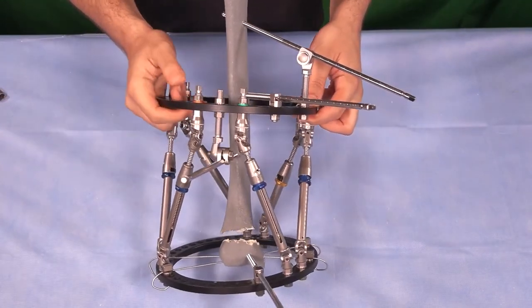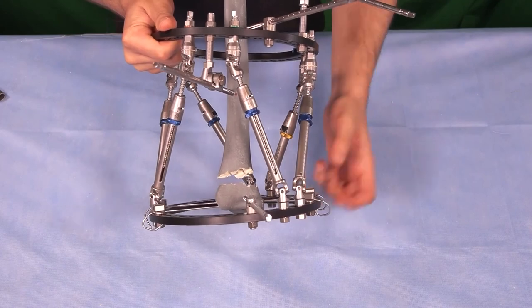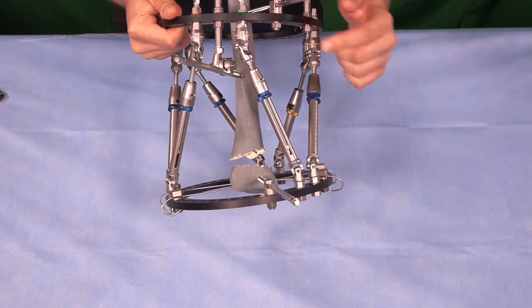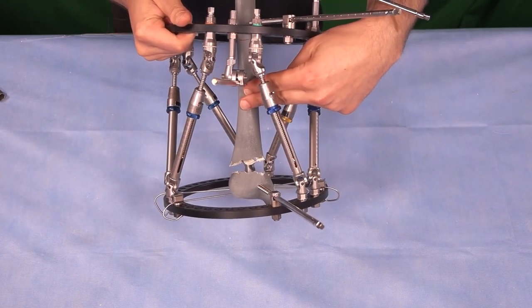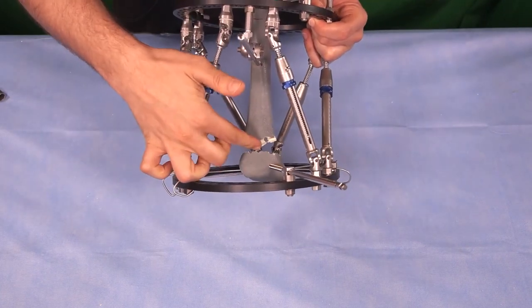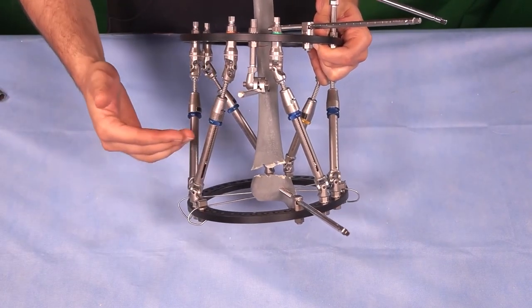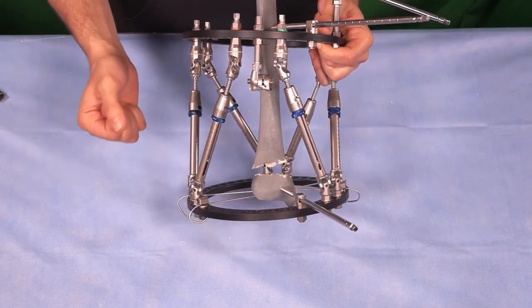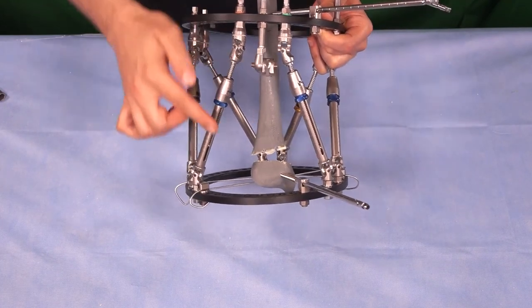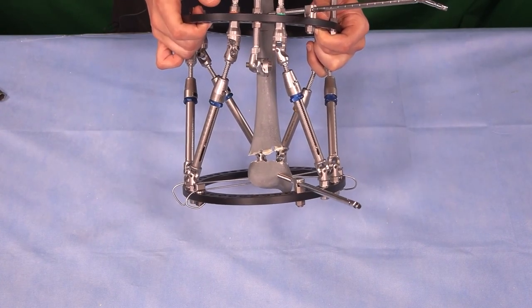We're done with the correction. You can see that a little distraction was applied to disengage the fragments, and the articular surface is now perpendicular to the diaphysis — an LDTA of about 90 degrees, which is what we aimed for. If you're unhappy with the distraction or your patient has a leg length discrepancy, you can run a residual program and apply compression or further distraction. This demonstrates the power of a circular external fixator to correct a distal tibia deformity with a supramalleolar osteotomy.